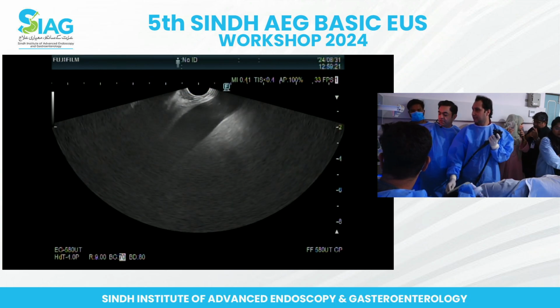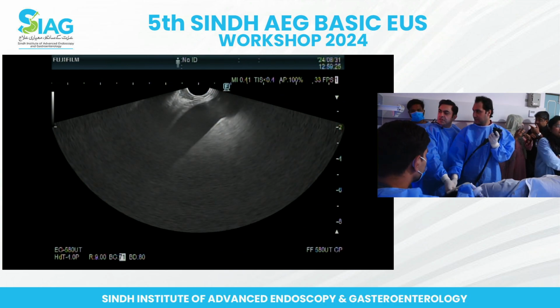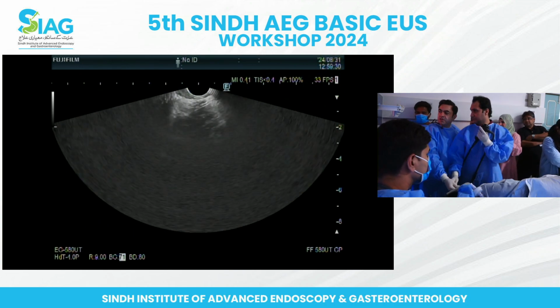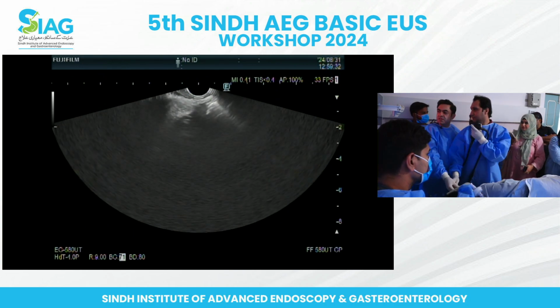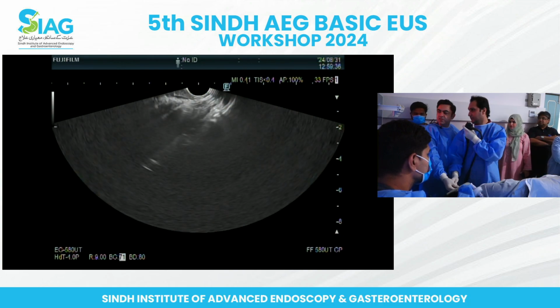Should I advance a little bit? No, just keep on rotating it. I'm just trying to see. Yeah, keep on rotating it so that you can orient yourself. Excellent. Keep on rotating it. So we're just trying to get the home station, the aorta.